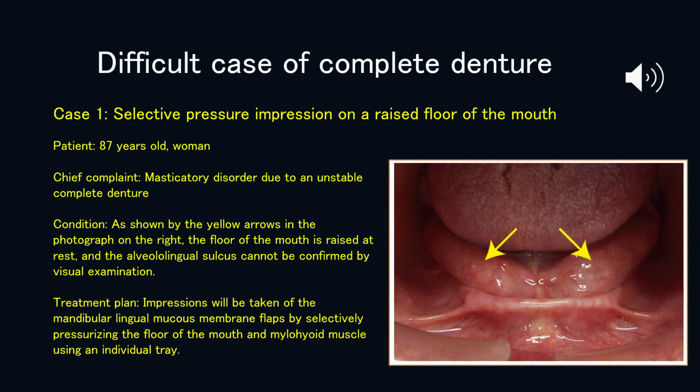Case 1. Selective pressure impression on a raised floor of the mouth. Patient: 87 years old, woman. Chief complaint: masticatory disorder due to an unstable complete denture.